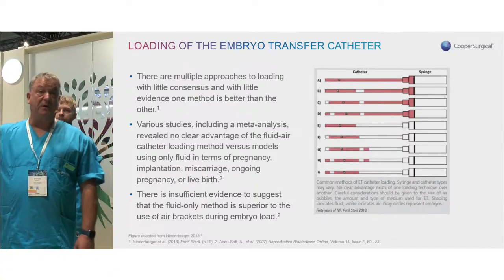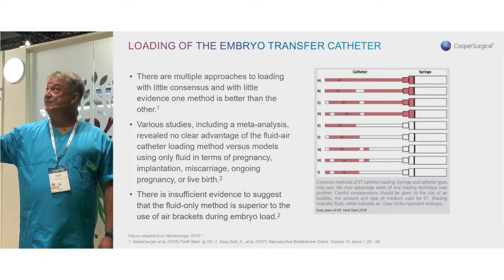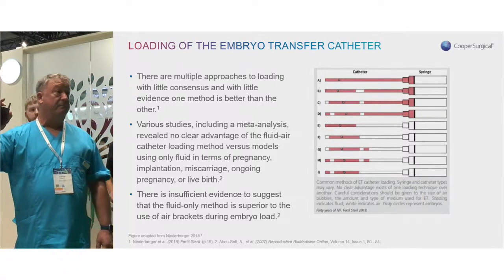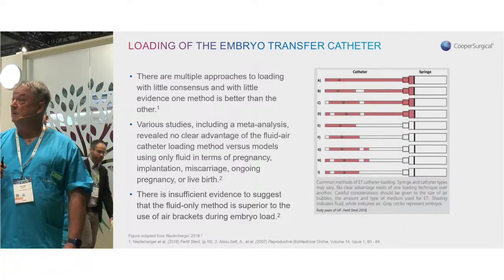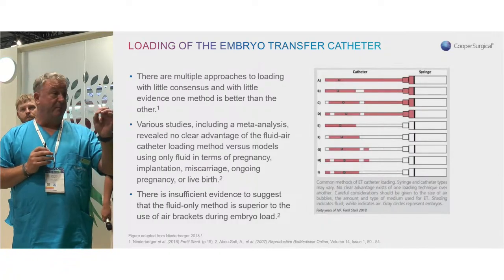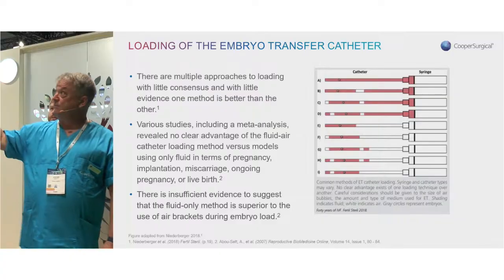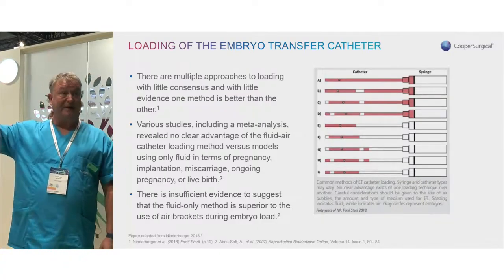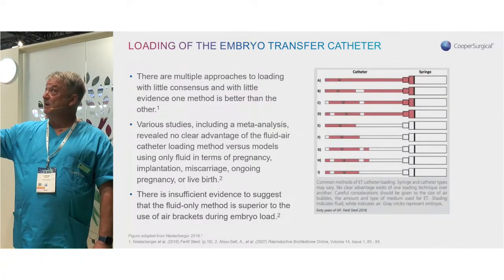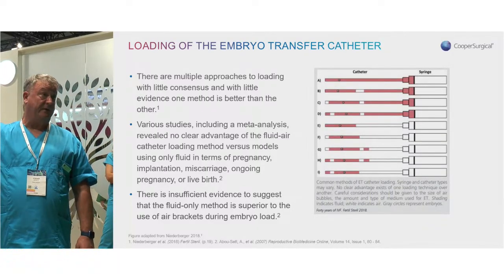We cannot keep increasing the volume to load. We have to have a maximum, but also we have a minimum, because if you load with too little volume, then that can lower the pregnancy rate, partly because there's a risk the embryo will stay attached to the catheter itself. So despite whichever of these techniques you use, doesn't matter, but the volume that the embryo sits in when you do the transfer does matter.